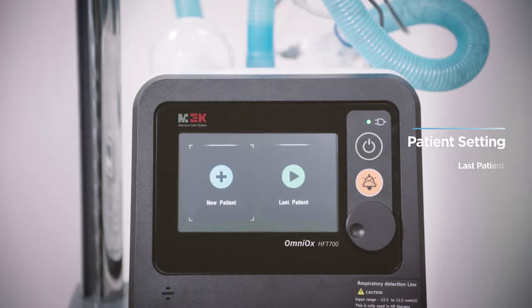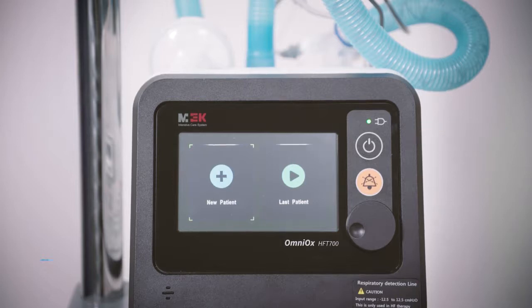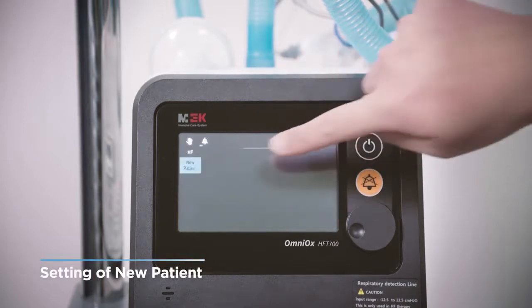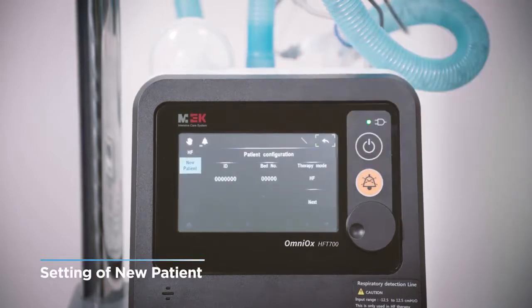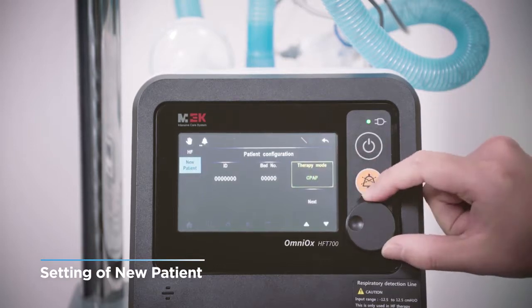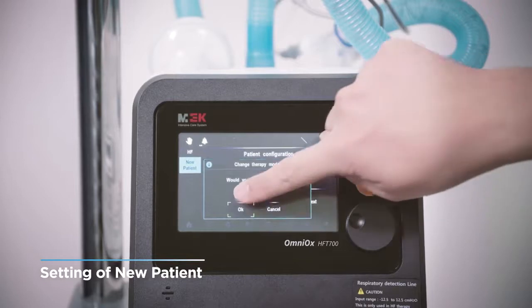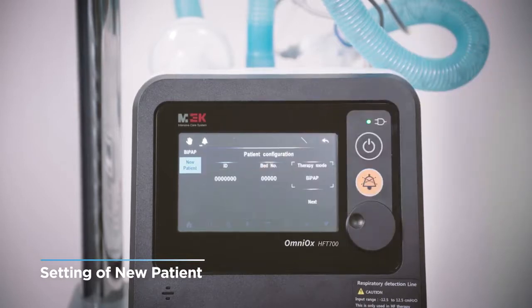If you select the same setting consecutively with the same treatment method for the same patient, select last patient. When selecting a new patient, the patient's basic information should be entered in order to link with the hospital's information system. If it cannot be linked with the hospital information system, this process is omitted. If you want to change the treatment mode and other configuration, touch the screen and then turn the encoder to change the mode, and press the screen or encoder again to confirm the changes.